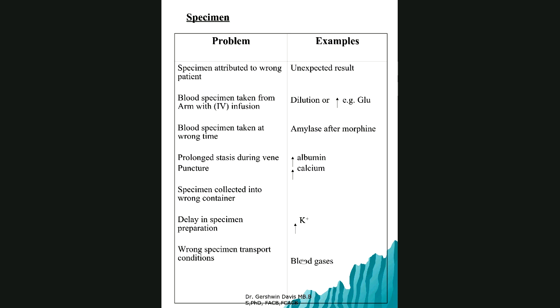And we know the transport conditions of blood gases basically being, it should be transported on ice, obviously. Capped, meaning there should be no air above the blood sample, right? And transported immediately to the lab for analysis. But as I say, use common sense here, because if you have a point of care machine in the intensive care unit, for example, you're not walking across 2 or 3 blocks or buildings to go to the lab.